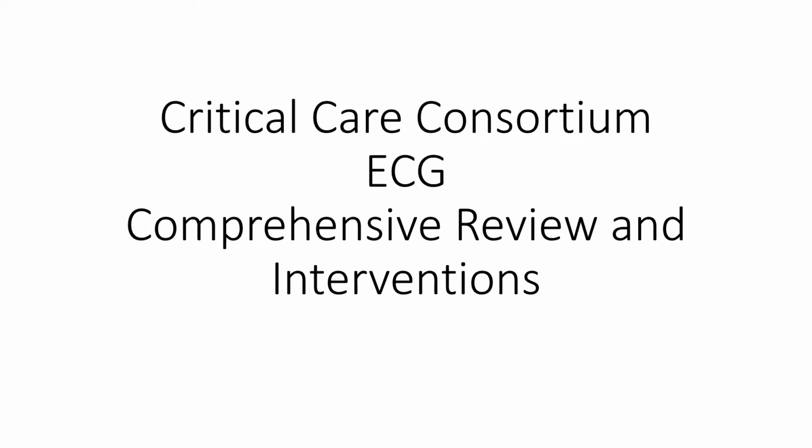Hi, this is Ginger Keene, and we will be doing the comprehensive review and interventions for the strips that you've learned and all the rhythms and what you would be doing for them.